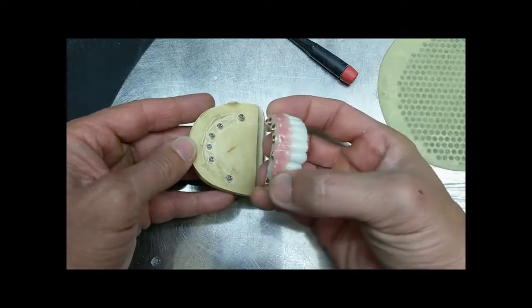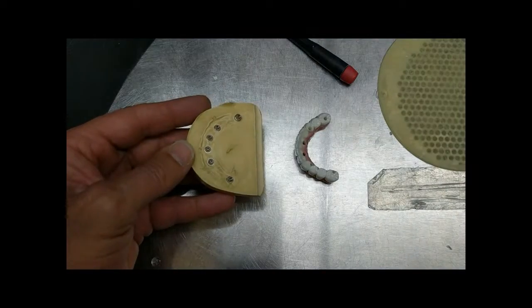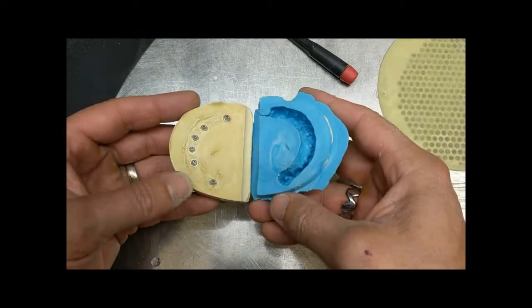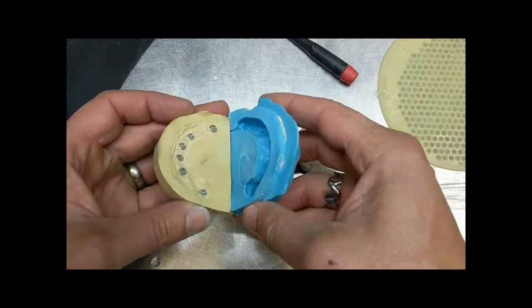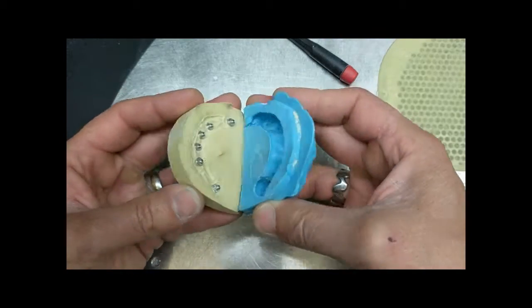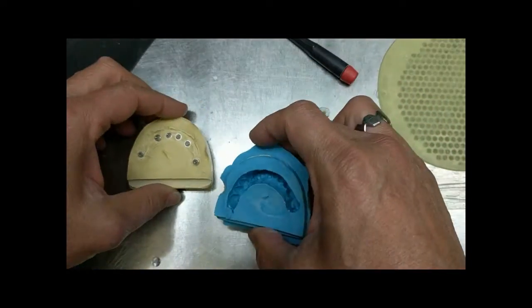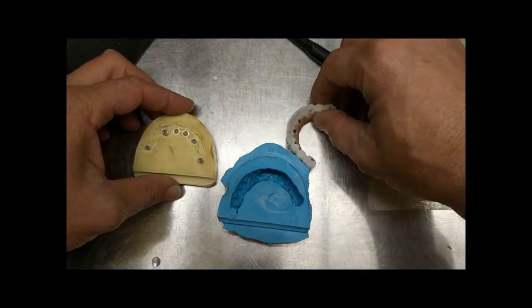Return the prosthetic to the patient and send the flask to the laboratory, along with an opposing cast and a bite registration. Also, if there are to be changes made, please capture full face, full smile photographs with the prosthetic seated.